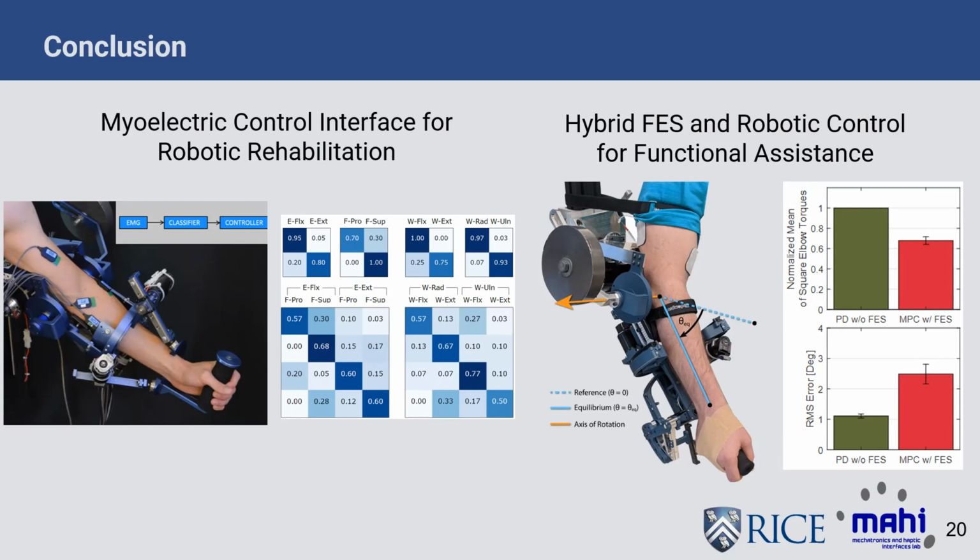Sure. I can just speak to the FES and robotics because that's my project, but the tuning that I do actually kind of abstracts out. I ask users to remain limp, trying to simulate SCI patients, and the algorithm accounts for how much capability the user is able to put in.